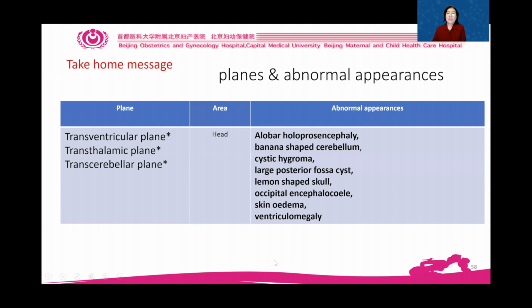So the 3 planes are very important: transventricular plane, transthalamic plane, transcerebellar plane.